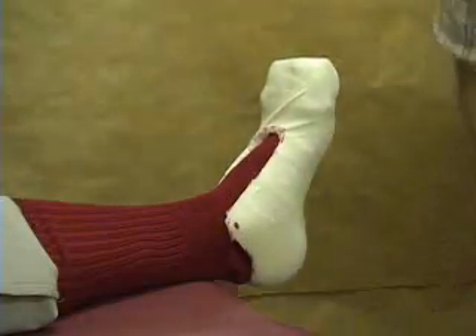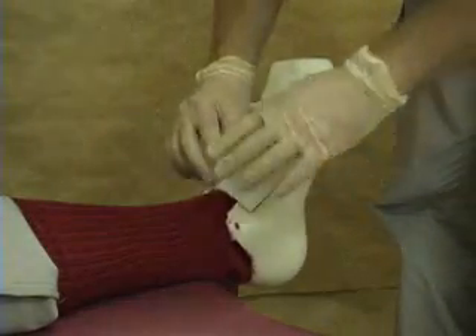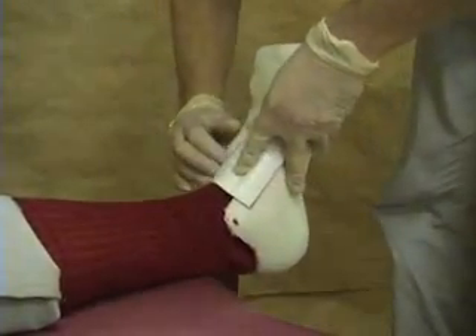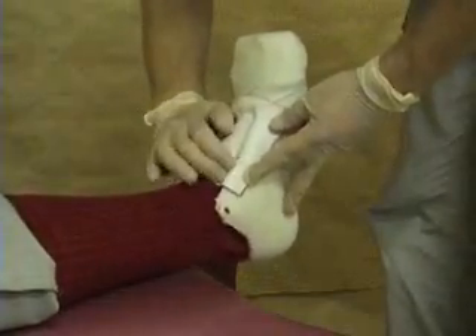We've got our soft thermoplast material here now. We're just going to make sure it covers everywhere. I'm just going to work it into that gap there.